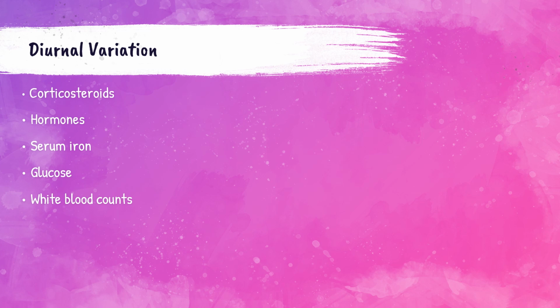If a patient is getting any corticosteroid levels tested, these will need to be collected between 8 a.m. and 10 a.m. or at 1600, which is 4 p.m. And these, of course, will be timed draws.